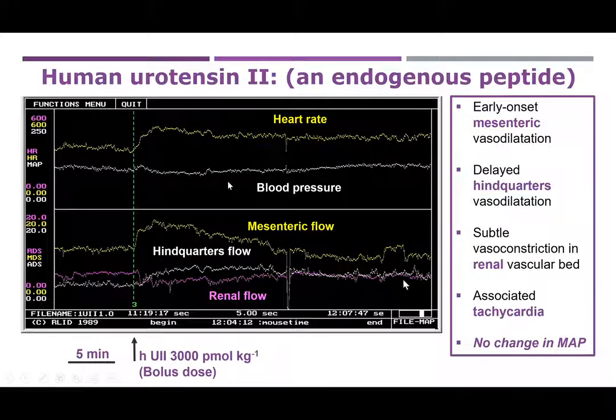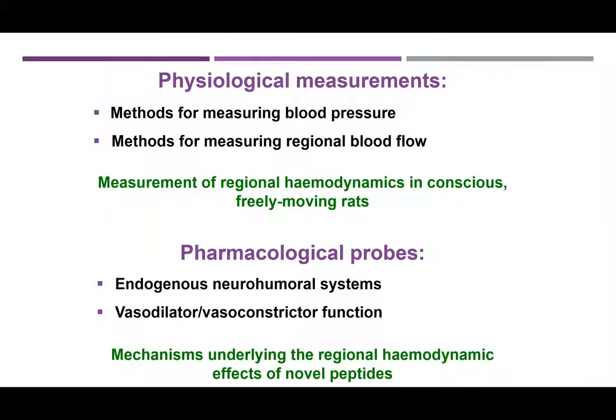So the two compensatory mechanisms here in terms of heart rate and what's going on in the vasculature are seemingly largely offsetting one another, but there are significant events that are taking place. And so the methods that we use using the Doppler flowmetry model allow us to measure both the changes in blood pressure and heart rate, and for measuring regional distribution of blood flow. And it's a method for us to be able to test a number of pharmacological agents.